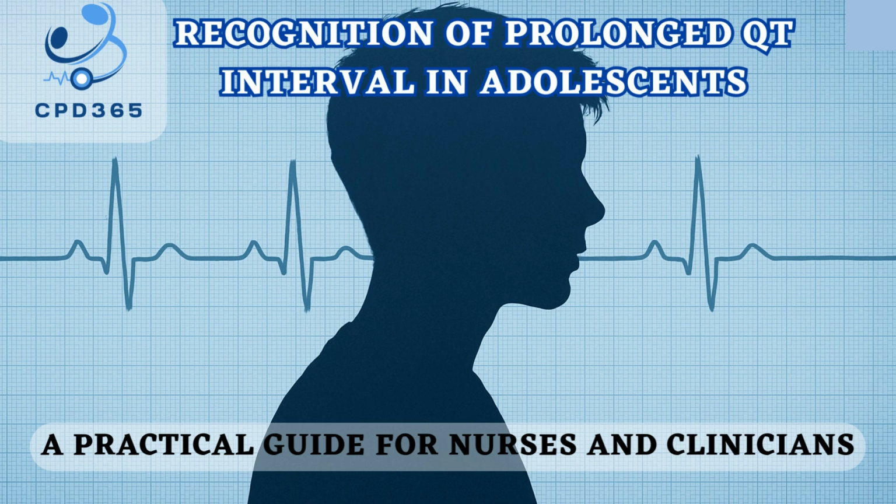Over the next two CPD hours, we will explore how to recognize normal versus prolonged QTc values, understand correction formulas, identify red flags, and apply a structured, evidence-based approach to interpretation and escalation.